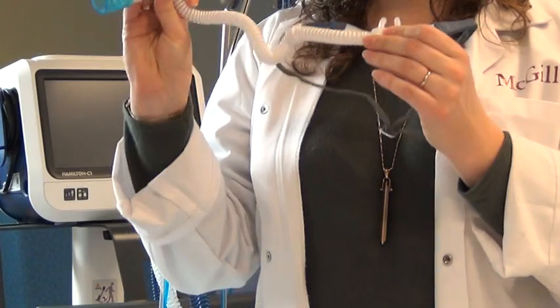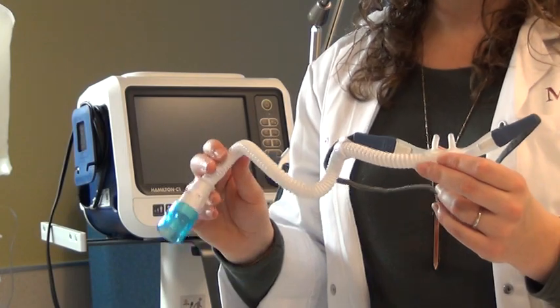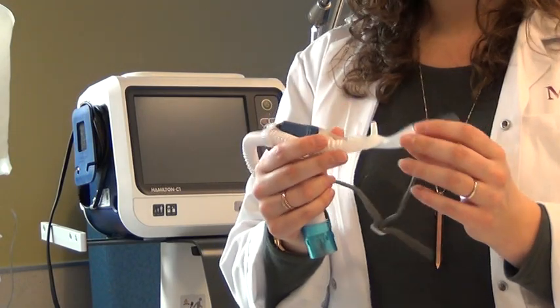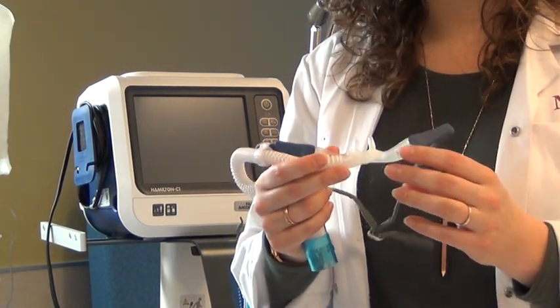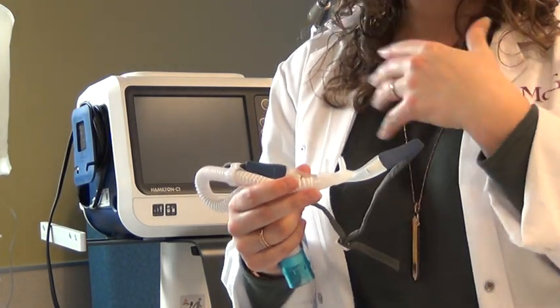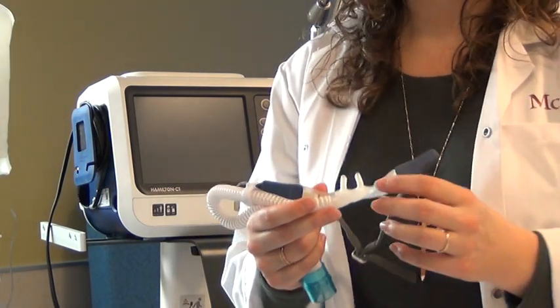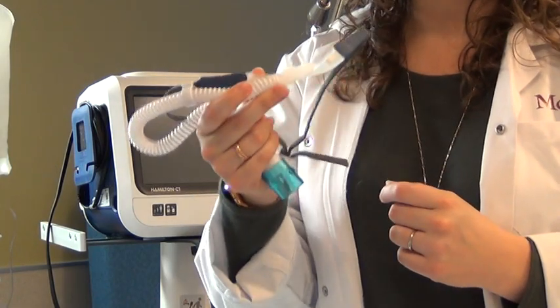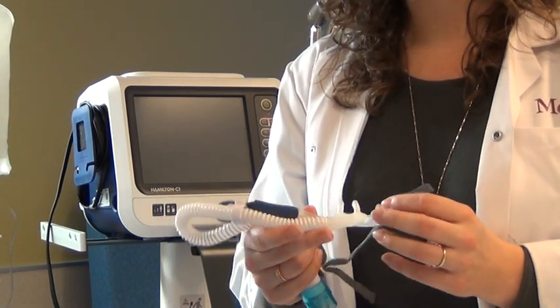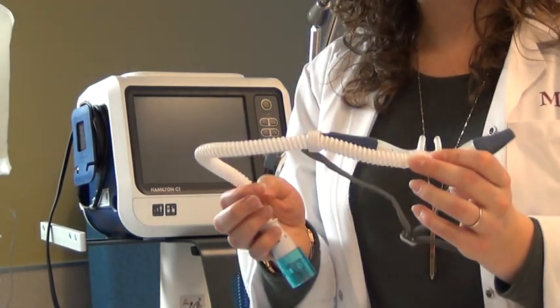So this goes into the patient and is connected to a device, to soft tubing that is humidified and heated so as to ensure that the patients are comfortable. We have a tendency to put patients that require oxygen therapy that don't need to be intubated on this. We will give this to them instead of a Venturi mask, because with a Venturi mask, if they want to speak or if they want to eat, they are unable to do that, assuming that they cannot tolerate simply nasal prongs. So we will put this as more of a comfort measure. So this is usually really helpful for those patients that really are oxygen deprived for whatever reason. So this is another device that you might hear, so it's high flow oxygen therapy.